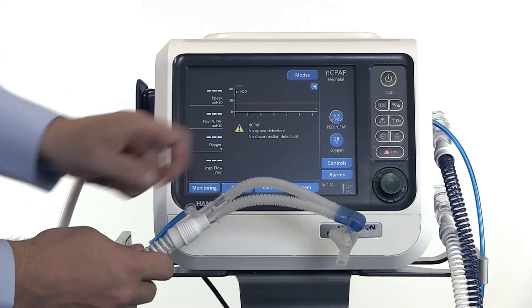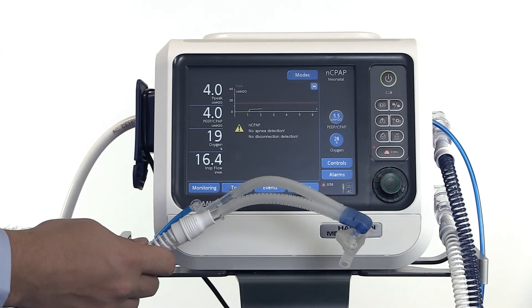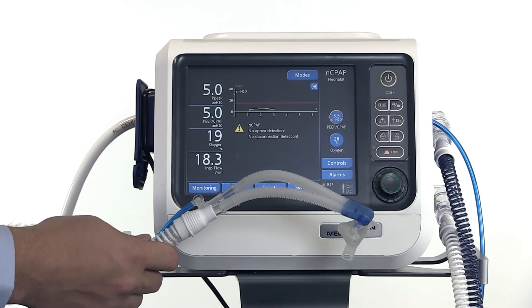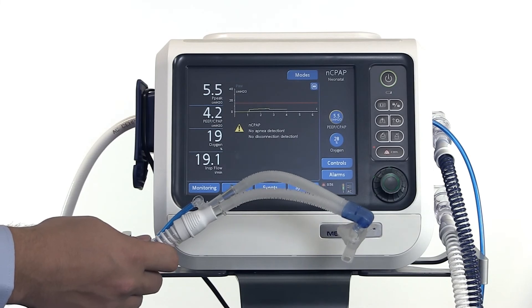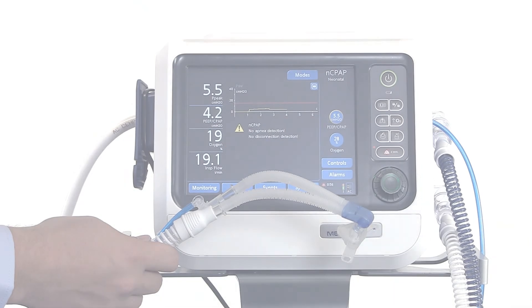The NC-PAP screen shows you a pressure curve and four monitoring parameters: P-peak, PEEP, oxygen, and inspiratory flow. Note that there is no detection for apnea or disconnection in NC-PAP mode.